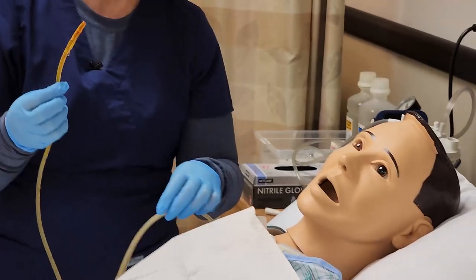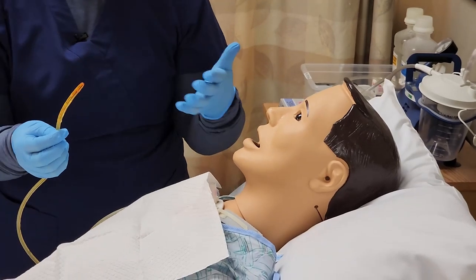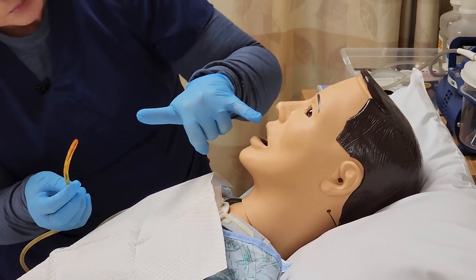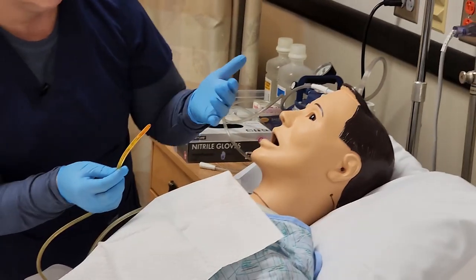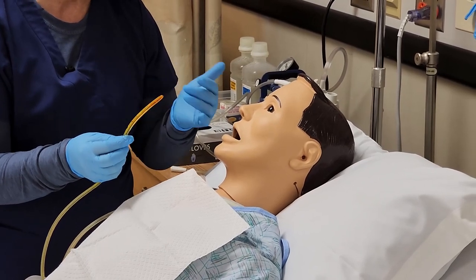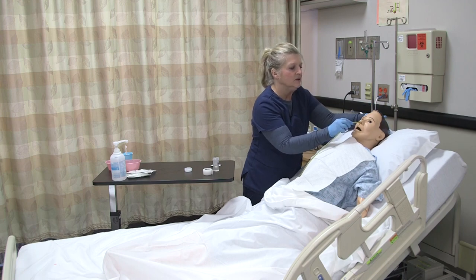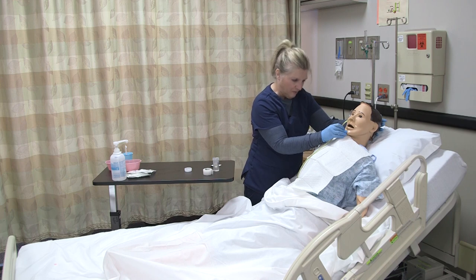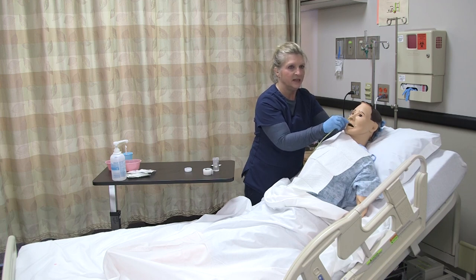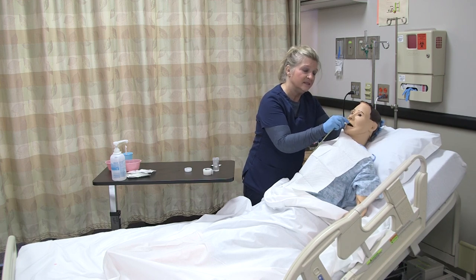Having my patient sit upright, I'm also examining the nares prior to insertion to find the more patent nares. Both look fairly patent and I don't see any obstructions, and the patient doesn't have a history of any septal defects or obstructions, so I'm going to use the right nare. At first, have the patient sitting with their head neutral. Once you get past the nasopharynx, you can have the patient chin tuck and flex their head forward to help pass it through. Then once you get to the oropharynx, have the patient take sips of water to help facilitate it going down into the esophagus.